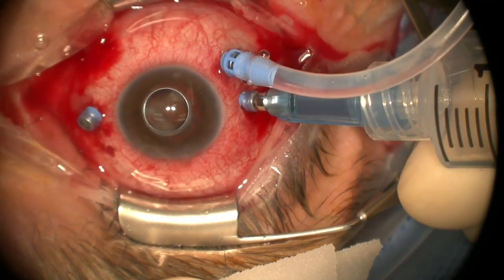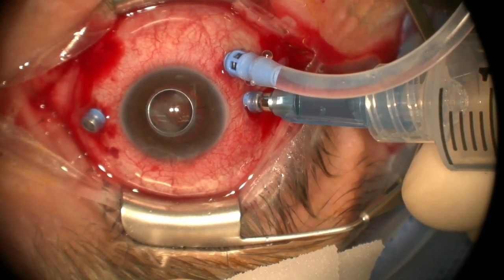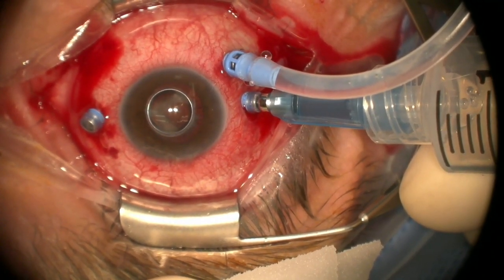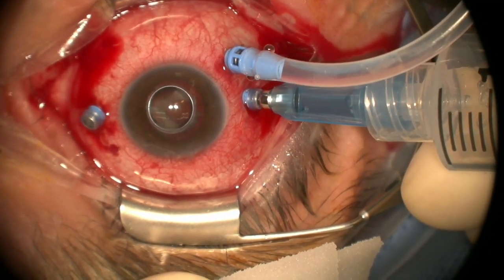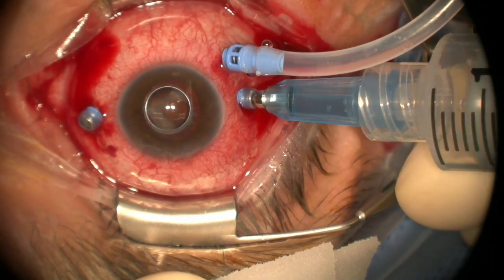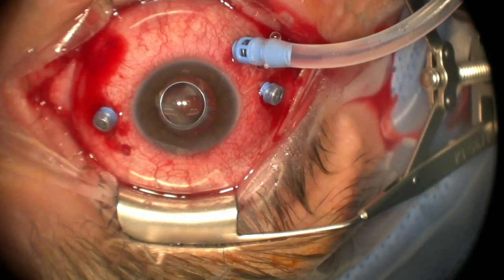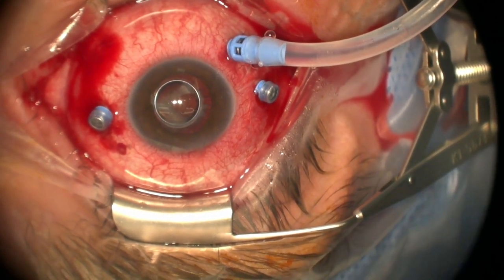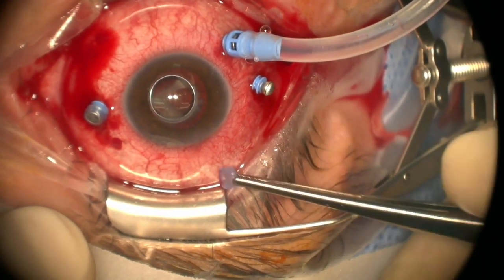So we have the oil coming out here. And it's a little slow. I wonder if we can speed that up by popping the cap off, maybe? Popping the cap off and putting the tip over the top? Yeah. You need this back. We're going to take another way to do this. There's another device. Instead of putting the cannula in the eye to pull out the oil, we're going to do it by putting the cannula over the top. We pull off this little cap.